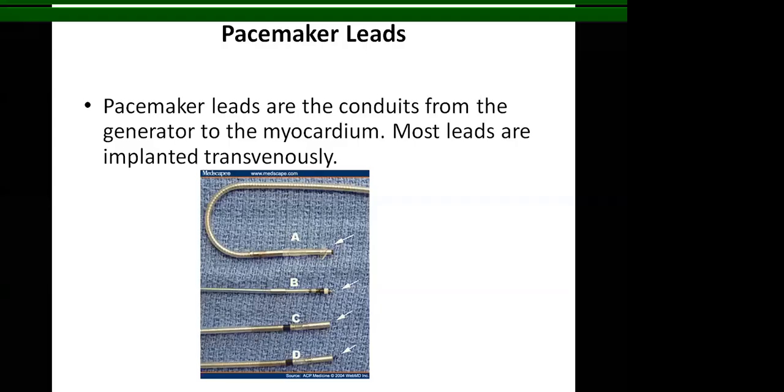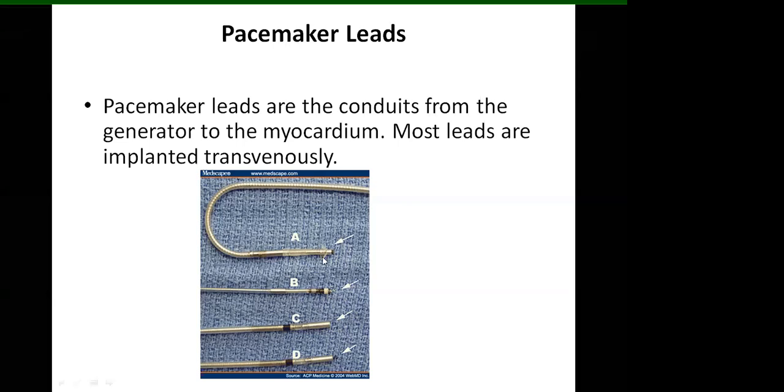Yes, sir. Okay, so permanent. We're going to the permanent pacemaker. We all know a permanent pacemaker can be single chamber or double chamber. It's only CRT-D that is three chambers, but we're talking about pacemakers. And we all know that there are different types of leads. This can come out in MCQ. So we have the screw leads and we have the tined leads. The difference is that with the tined lead, you don't have to screw it.